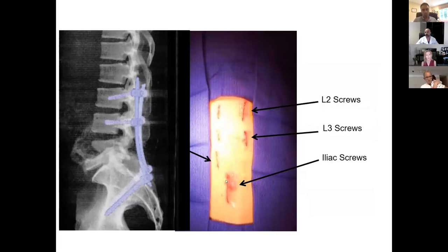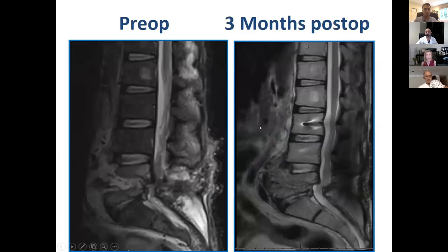A few people like Mike Wang and others have described the PERC iliac screw fixation. So all of this was done completely percutaneously. And this was his 3 months post-op. I did not do a formal decompression. I did not do a laminectomy.